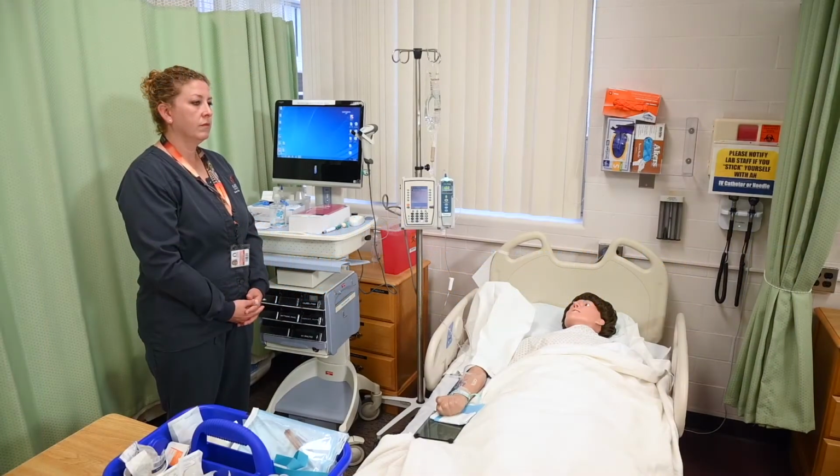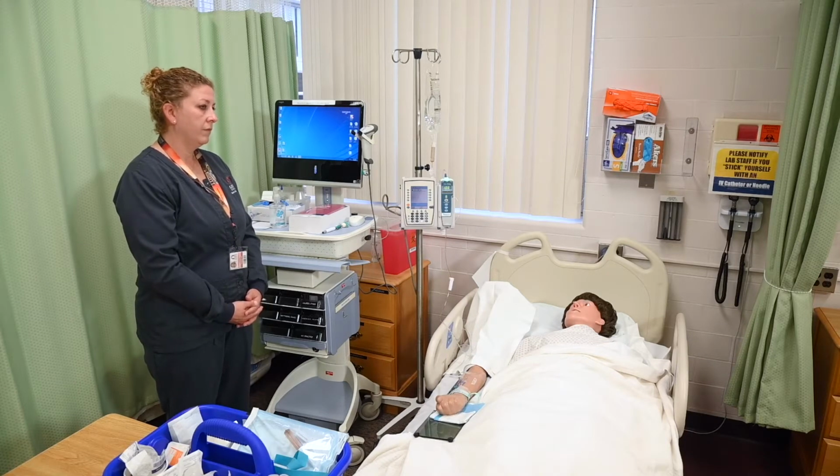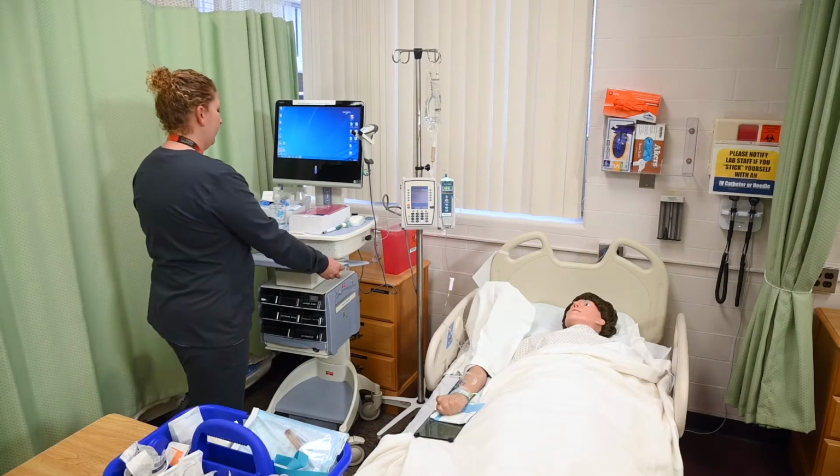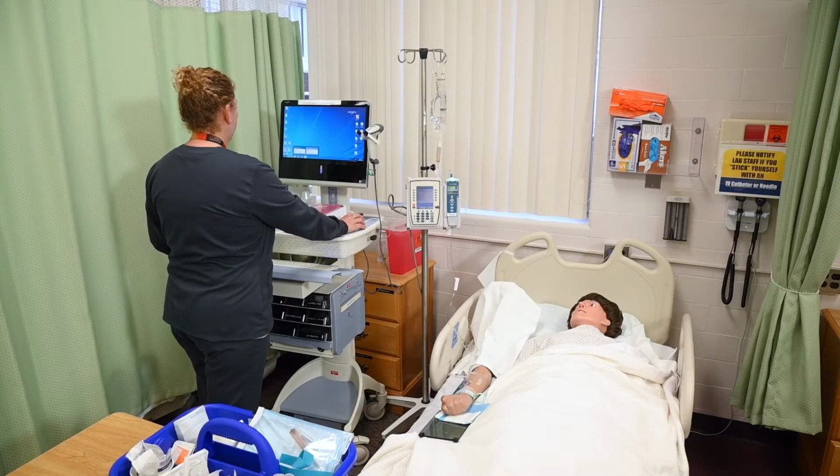Today we are taping the NUR 365 revised Administering IV Push and IV Piggyback Medications Formal Competency. And our student nurse today will be Sarah Enriquez. She will begin by verifying the healthcare provider's orders with the medication administration record.